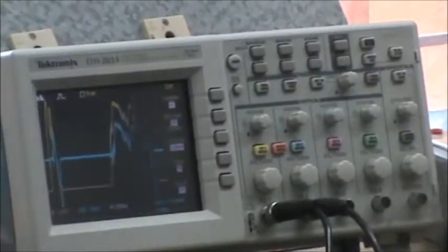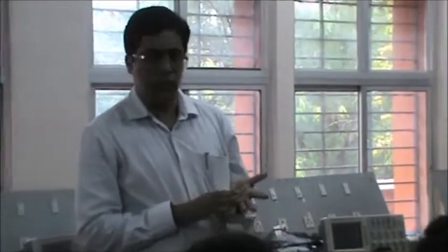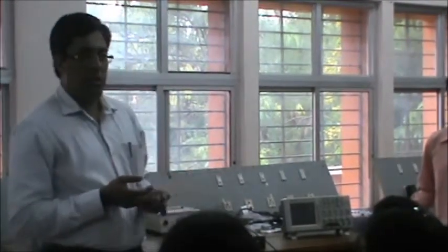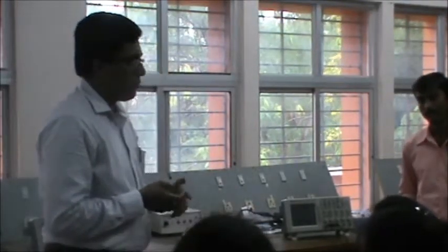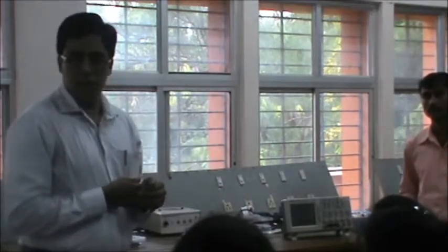See, basically when it comes to electrical safety, when we talk about all this coupling, we can achieve different kinds of coupling. It could be an optical coupling using an optocoupler, or a mechanical coupling using a piezoelectric crystal, or a magnetic coupling using a transformer, or something like telemetry here. So different methods can be used to achieve this electrical isolation.